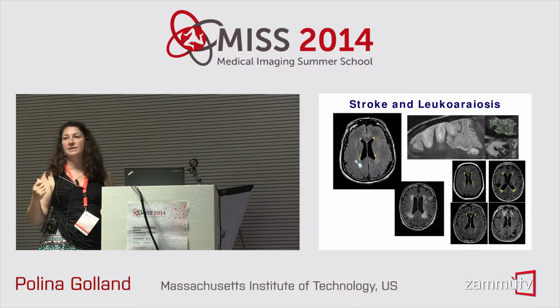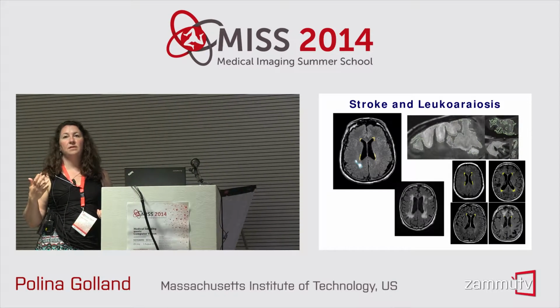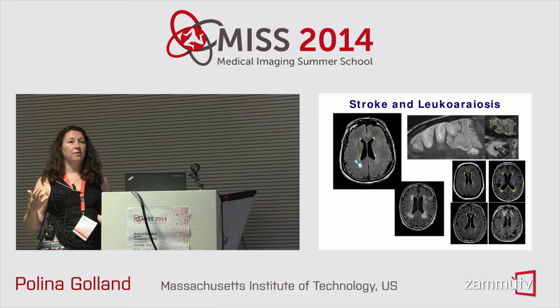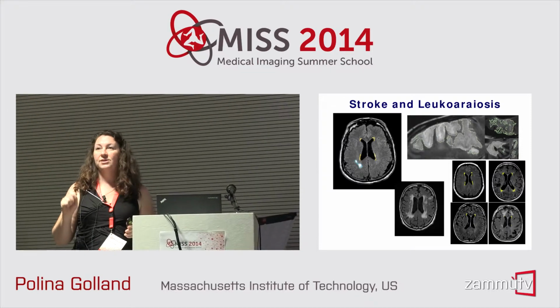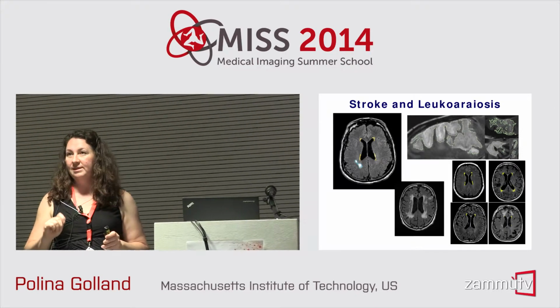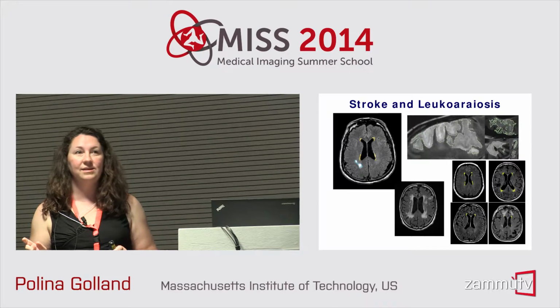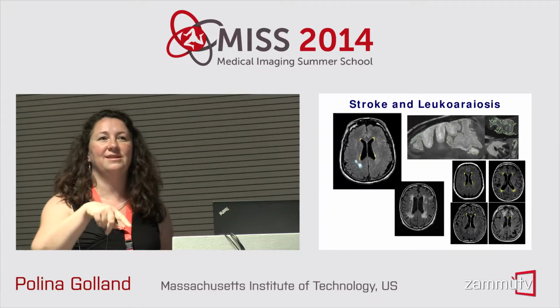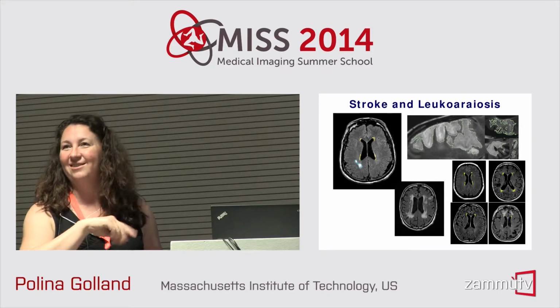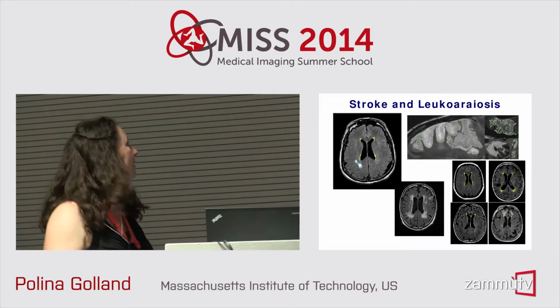These images emphasize certain properties of the tissues that are of interest in the study, and it's not the acute stroke. Acute stroke actually doesn't show up in these images, and the reason we want to study these images is because they show two interesting things. Well, one interesting thing and one nuisance that we're going to get rid of. It's the usual story in medical image analysis.